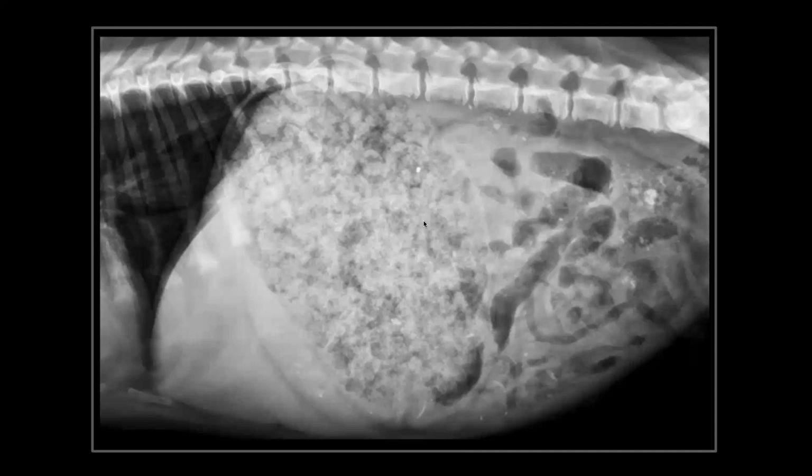And here's significant food. So gastric distension with food or with a foreign body. It's hard to tell, but you've got food distension or soft tissue density material in the stomach.